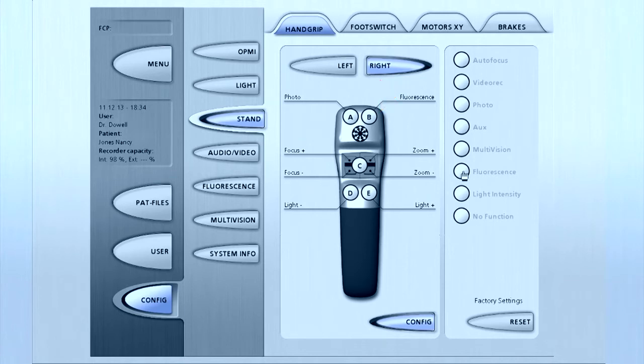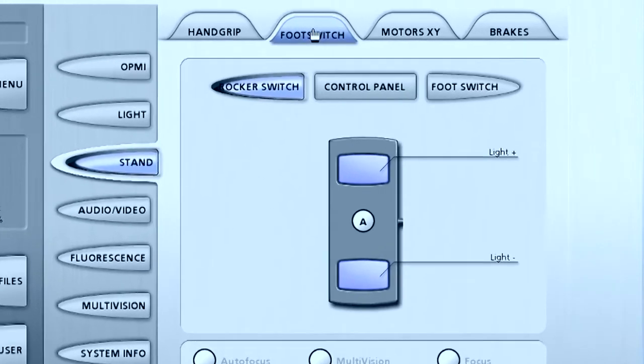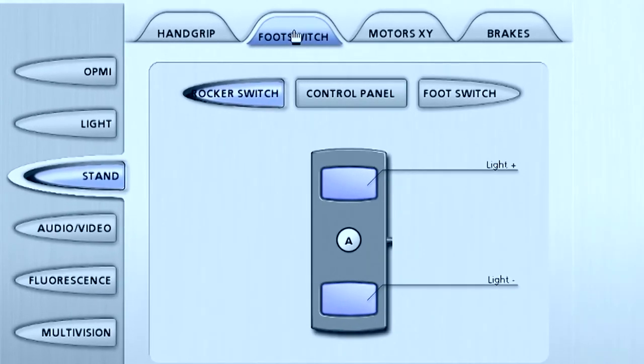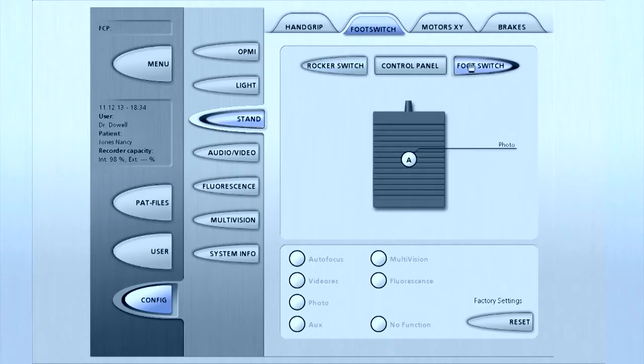To configure the foot switch, select the foot switch tab at the top of the screen. Each of the three buttons — rocker switch, control panel, and foot switch — offers different options for functions like zoom, focus, light intensity, and fluorescence. To configure the programmable keys on the foot control panel, press A, B, C, or D and select the desired function in the menu below.